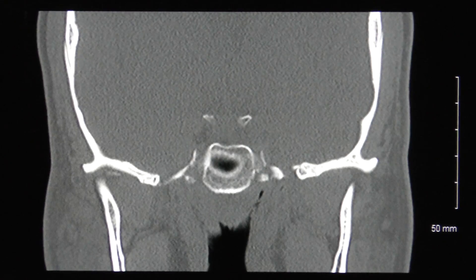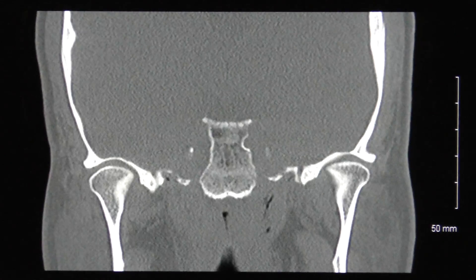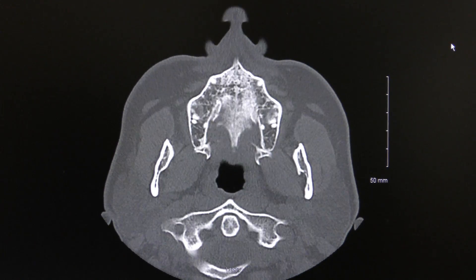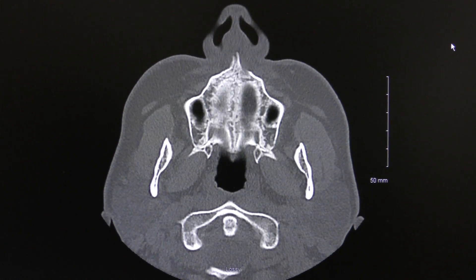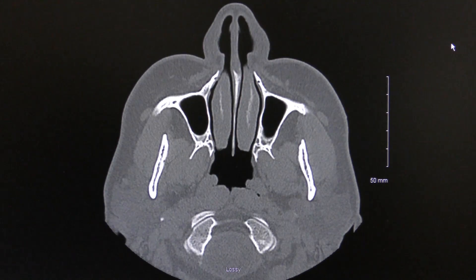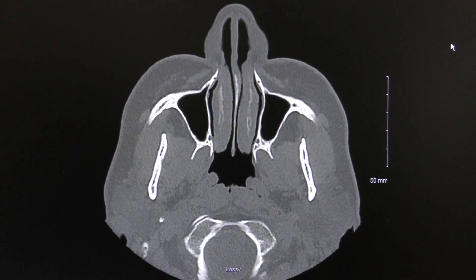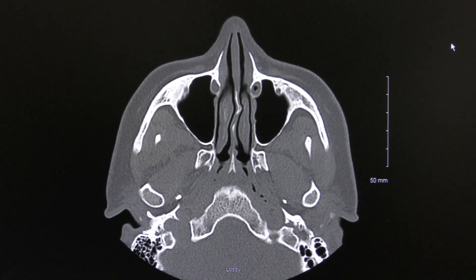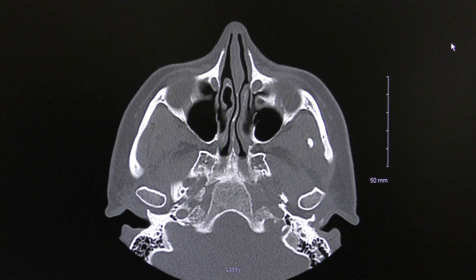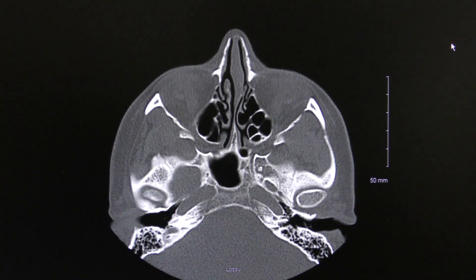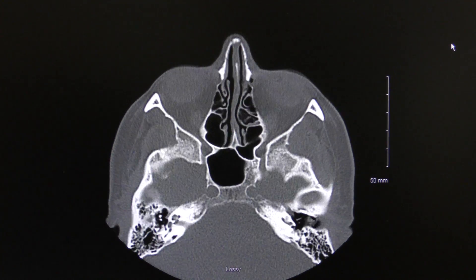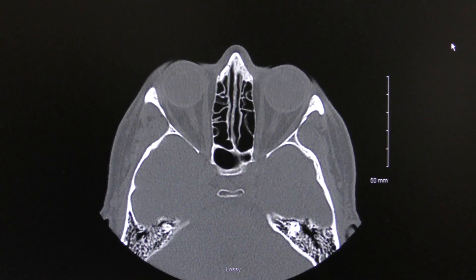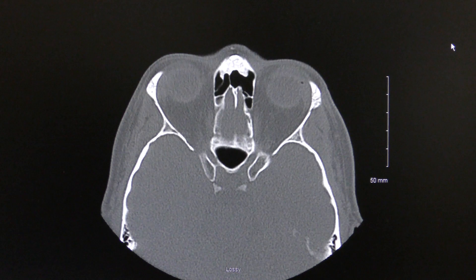In CT scans, there are basically three colors: black, white, and gray. Air is black, just like the black around the head. White is bone, just like any standard x-ray. Things that are gray denote fluid or soft tissues like the brain, eye, and tongue.